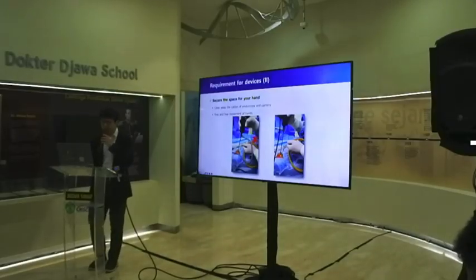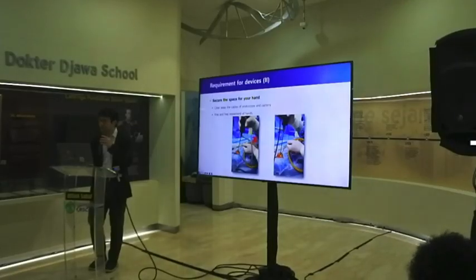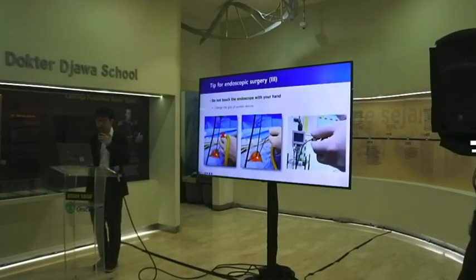If the line of the light source or the camera is disturbing the surgeon's hand, it is very difficult to handle. So always keep the cables away from the surgeon's hand. That's why the assistant is important.